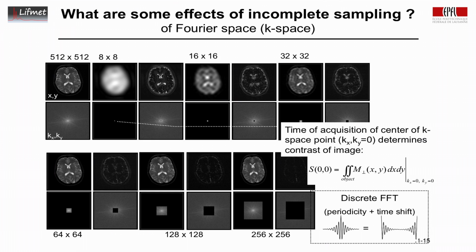So what this means in terms of data acquisition is that if your subject moves close to the central K-space points, you're going to have a fairly big impact on the image, whereas if it moves at the edges, where there's very little signal, the impact is much less. So crossing through the 0 K-space point defines the contrast and also the magnitude of the motion artifacts.